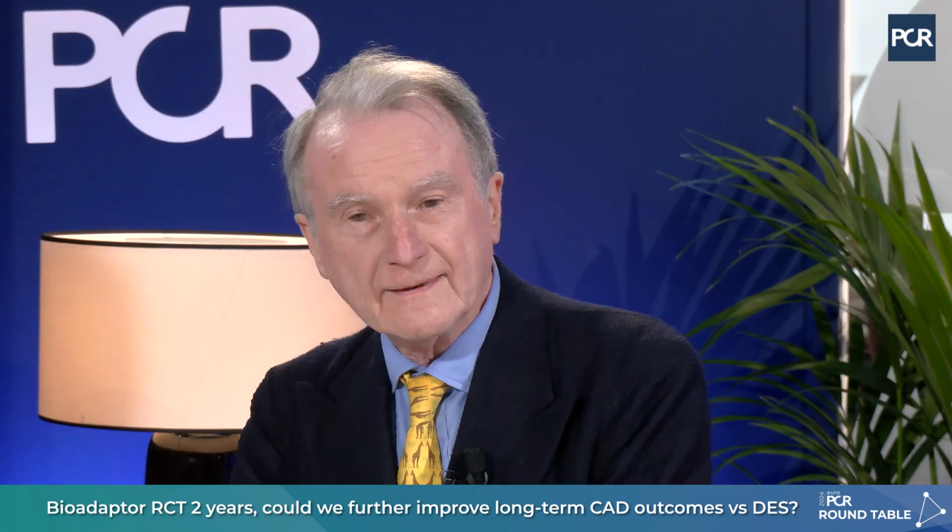Well, drug-eluting stents are still a stent, which is a permanent device which stays as it is at the time of implantation. The vessel is not really a permanent tube, it has the capacity to remodel, like Glagov, and has the capacity to pulsate in systole and diastole. And these two features are totally negated by a permanent metallic implant, even if it's drug-eluting. And this fact may have an impact, not necessarily at 1 year, but when we extend the follow-up to 3, 4, 5 years.